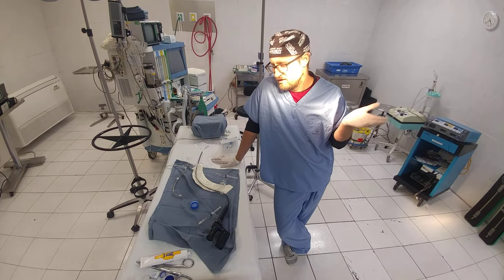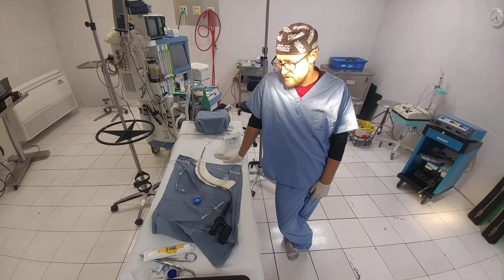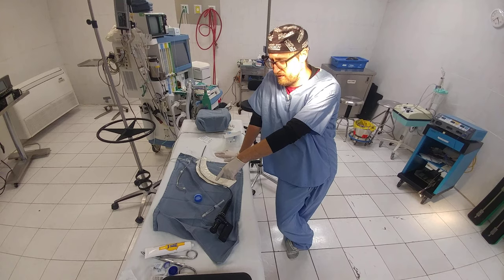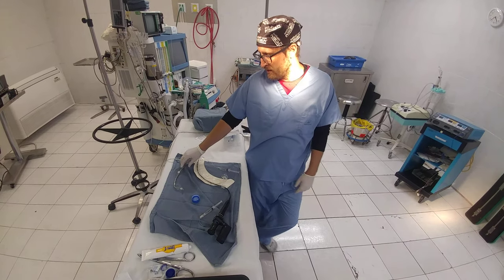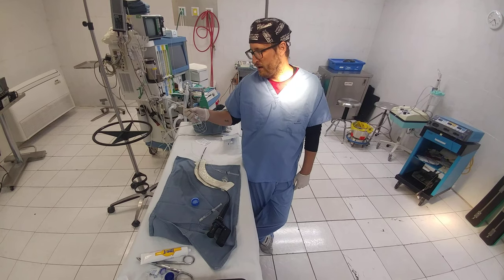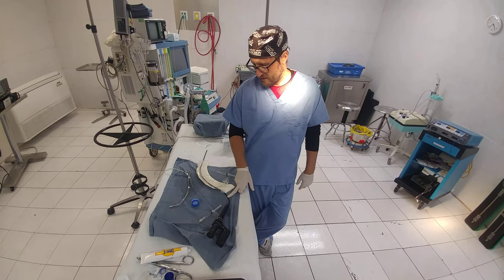We're going to do an awake intubation and just see how long it takes with just topicalization. I'm going to use 5% lidocaine. I'm going to start with a little bit of lidocaine gargle, and then I'm going to use the Batum atomizer that's kind of home-built here to get the deep oropharynx and stuff like that, and then use the scope to intubate.